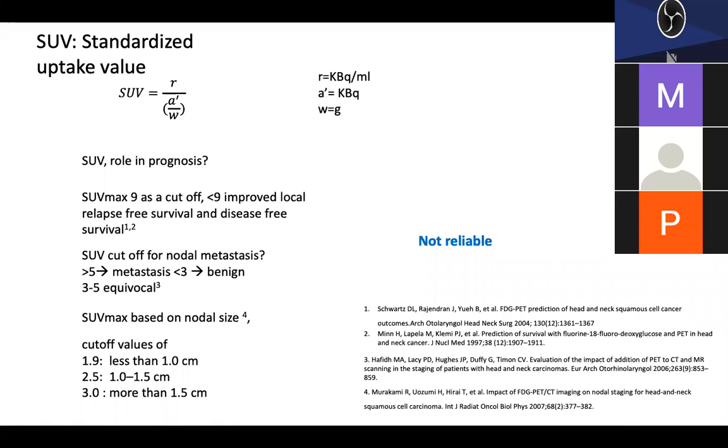Imaging of choice. Correct. And for our regular treatment naive cases, CECT of head and neck along with thorax is sufficient. However, in recurrent cases, a PET-CT will have incremental value. Is that right? Yes. If in initial cases there is a possibility of metastasis, for example the patient is complaining of bone pain and so on, then obviously you can go ahead with the PET scan.